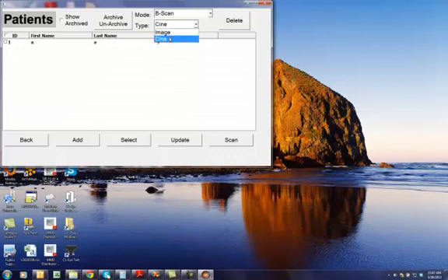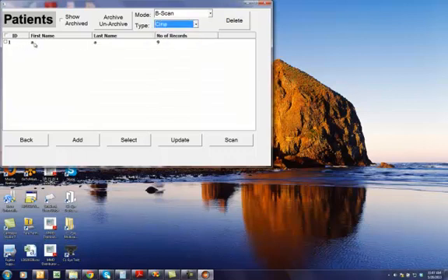One is an image file, the other is a Cine file. A Cine is actually a movie file. And here are the list of your patients.